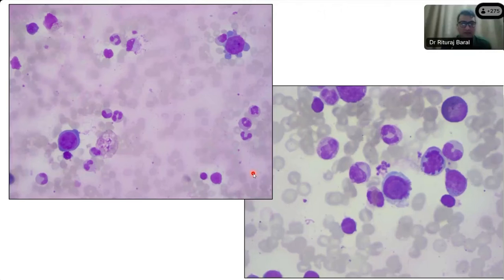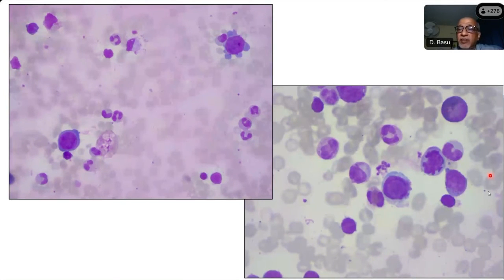Again, this one. Here's another one which has what are called the dog ear or the slightly blebbing of the cytoplasm. And notice here, what else does this cell show? These cells show intranuclear inclusion, sir. Almost like an inclusion, like intranuclear inclusion, right? Yes, sir. All of you, I hope you've got these pictures.